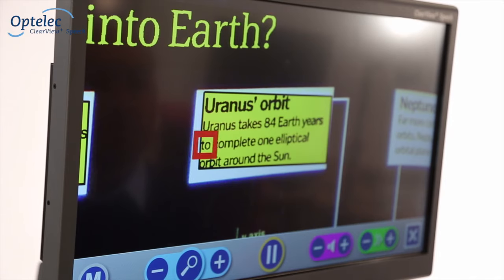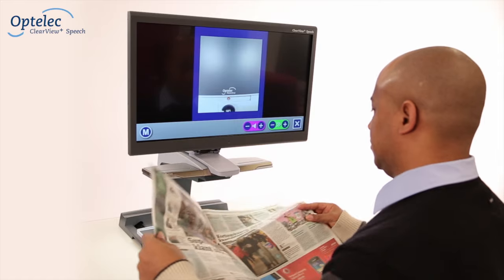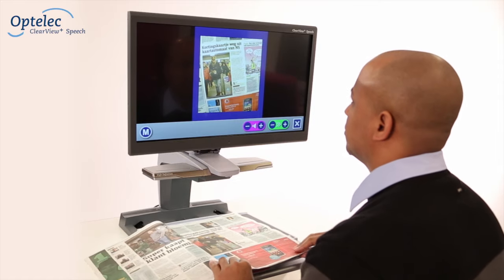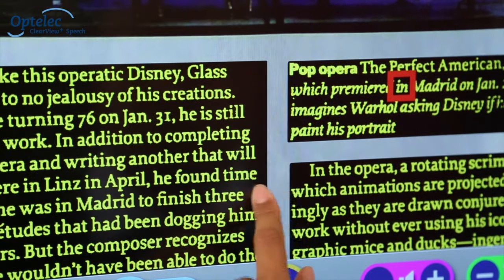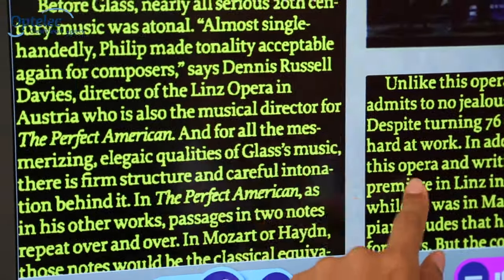The Clearview Plus Speech allows you to read and listen to your newspapers, letters and magazines with an integrated touchscreen and instant point-and-read technology.